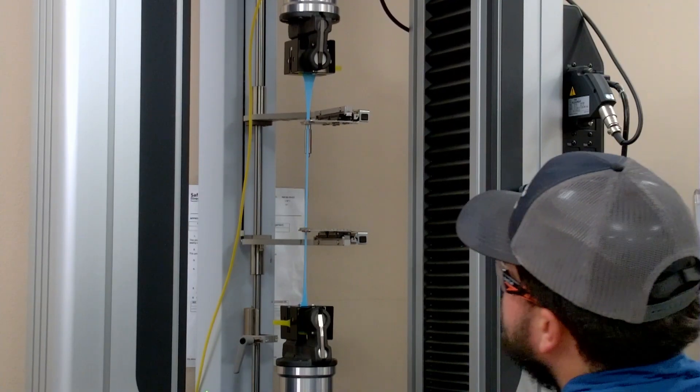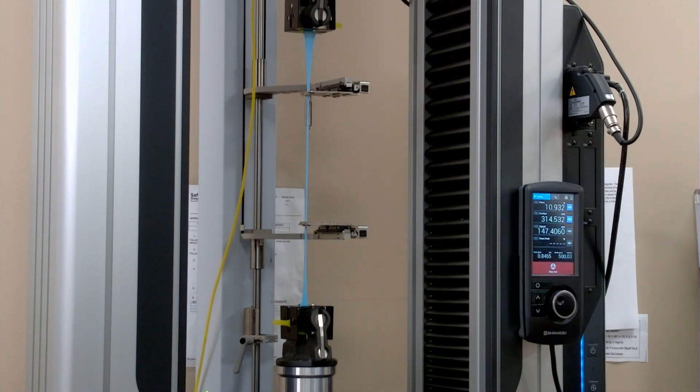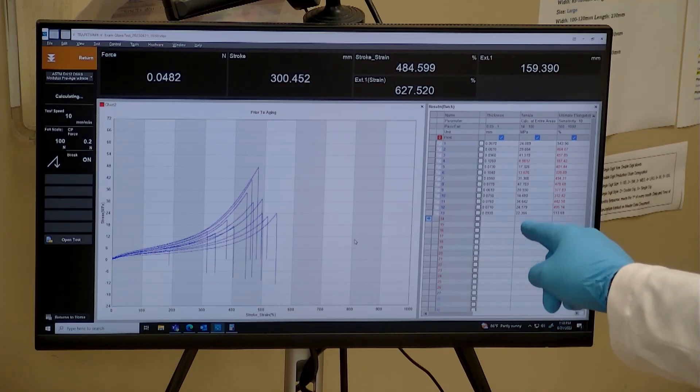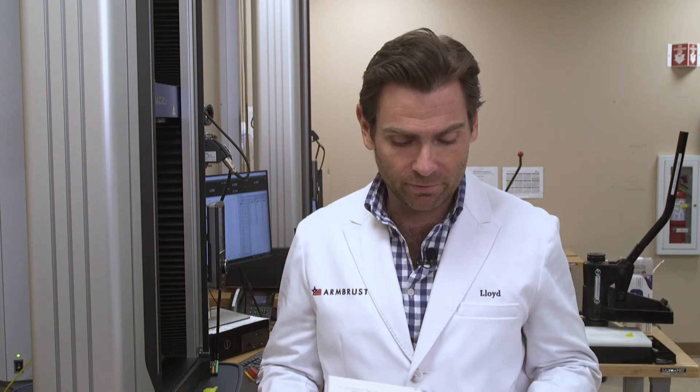That's like the second best glove we've had so far, which makes sense — it's 510K cleared. The FDA doesn't typically mess around with this type of thing; they keep their manufacturers in line. Look at that — above 500%. Tensile strength of 22.3. Beautiful curve. If you know anything about gloves, you know that's a good curve. 513% elongation — second best glove we've tested. I don't love the box of Litis, but I like the results. Good job, Litis. Gloved hand, thumbs up. Thank you for checking out this video — I'll catch you on the next test.